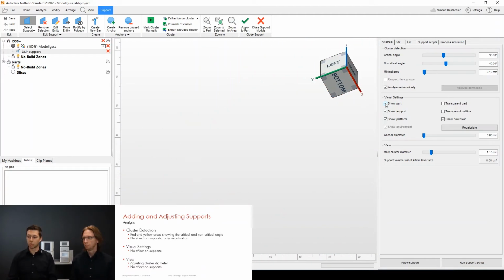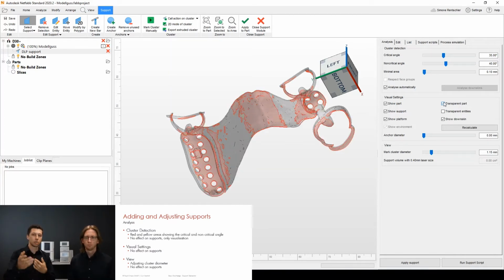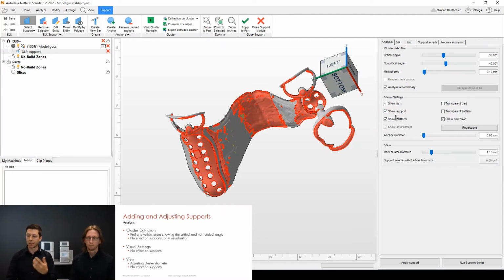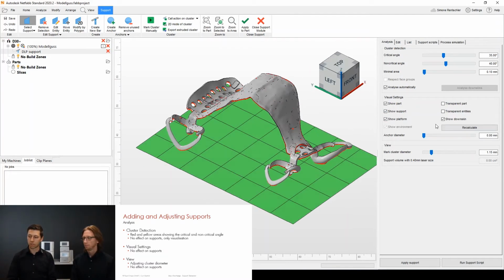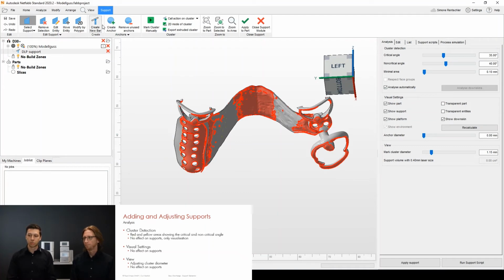So you can say, I don't want to see the part at all because you already got supports and just want to adjust the supports. You can also say, I don't want to see the part properly or completely. I will see a transparent part. So it's a little bit better to see through where the supports are placed and so on. For example, you can also disable the platform. The most important in here for us is the anchor diameter. You can see it's already set on 0 here. Usually the standard is set, I think, on 2 millimeters, but just so that you see what this is doing.